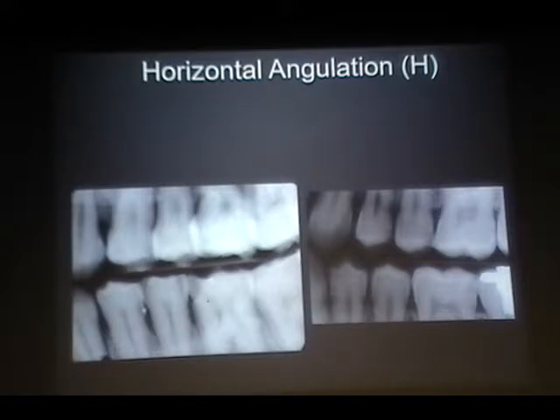But you have to see that you captured the distal of the canine in one view, and in the next view, did you open the contacts, right? Because we are all different, right? Our mouths are different, teeth are different. So we may have to make some adjustments when getting the images. But the whole idea is, you should know what is ideal. Can we get close to the ideal full mouth series? If you start cutting corners from the very beginning, then, as I showed you in some images, that's where we'll end up with those full mouth series.